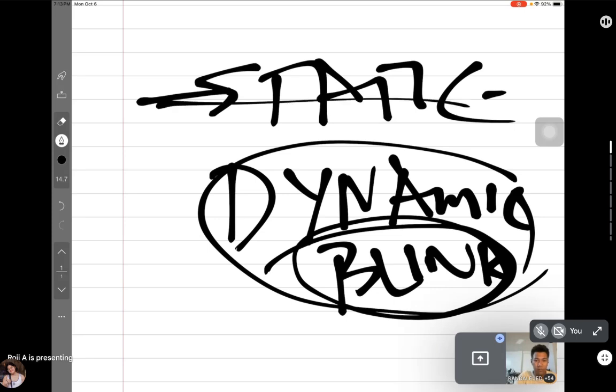No. So you're doing static. You said, look to the right. Did you say blink? No, Doc. So what are you doing? Static, Doc. Very good. Look up. Static pa rin, Doc. Very good. Look up. Blink, blink, blink. Dynamic na, Doc, kasi may blinking.